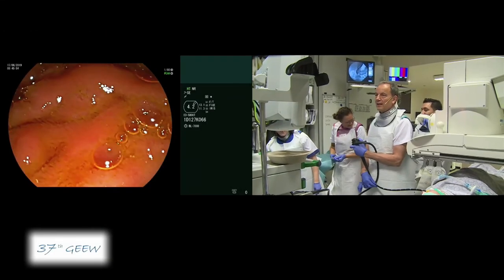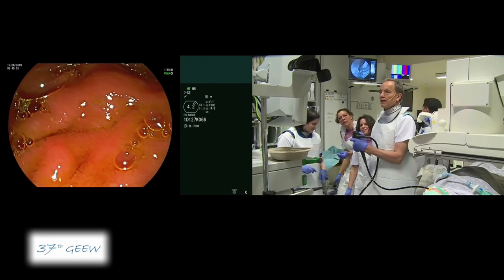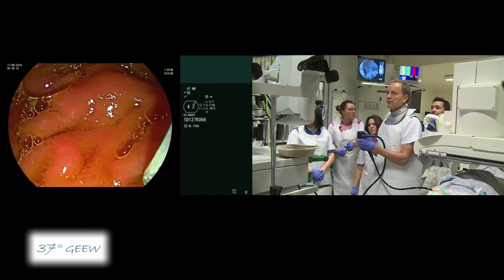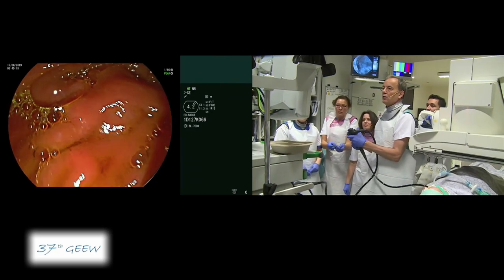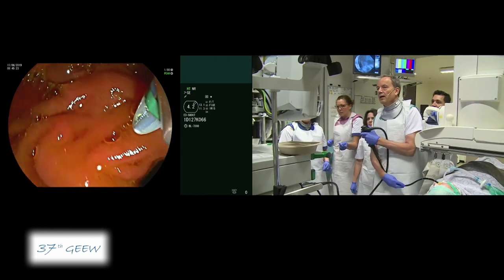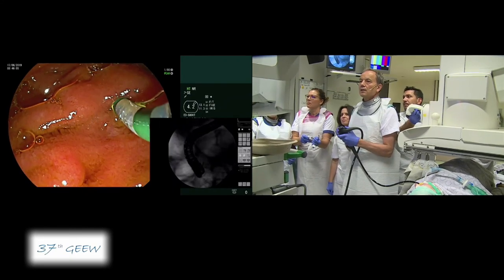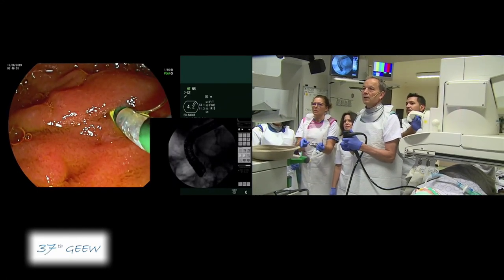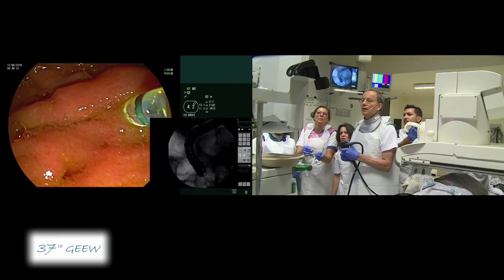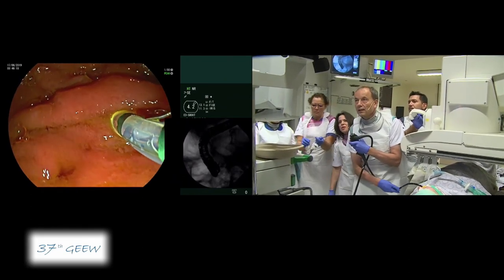We can already identify the papilla, which is obviously quite small. For cannulation, I'm using the Omnitome from Cook, preloaded with a 0.025 guidewire. There appear to be two different orifices — normally that would be the biliary orifice.